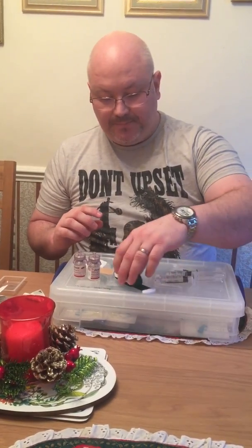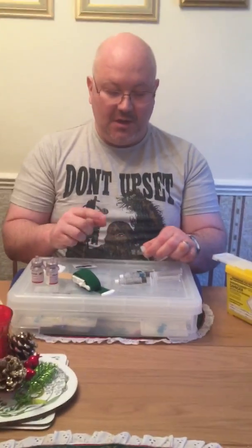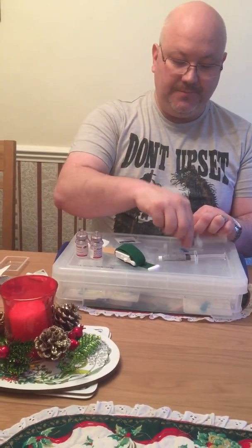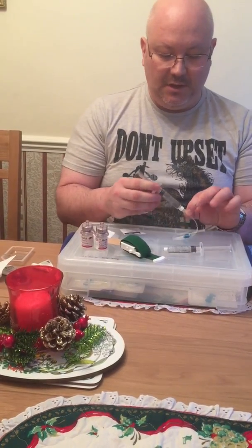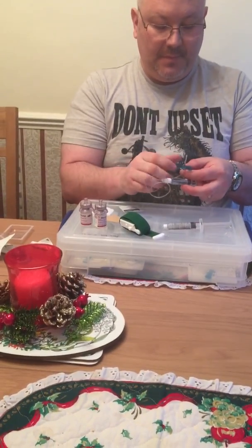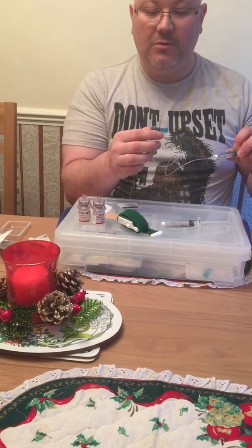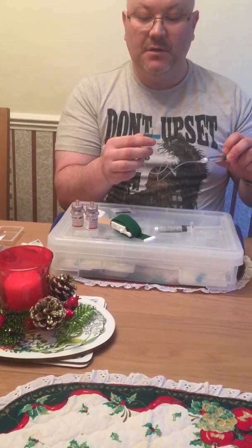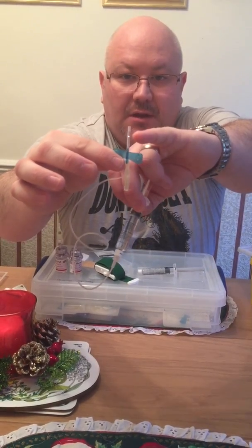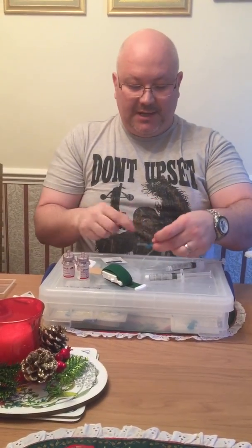They're ready. Now because I'm self-administering this, it's going to be quite difficult to put the needle in and then take the tip off. So what I do is pre-charge the needle. You do that by removing the top of the butterfly needle, screwing on the first syringe, and then very gently just push until the whole tube and the needle itself is filled with the clotting factor. You can see the clotting factor filling at the top part there. There's no need to press it really hard. Now that's fully charged.